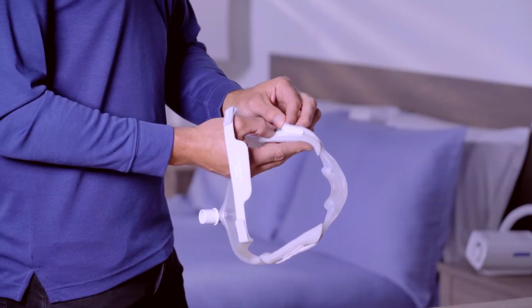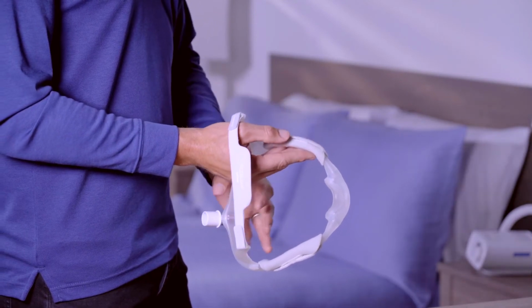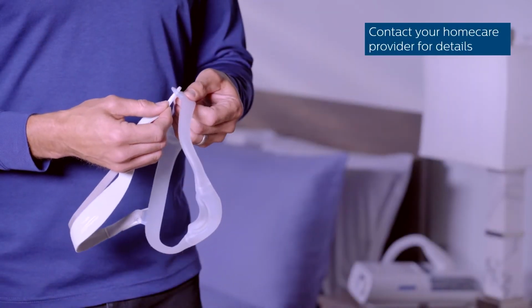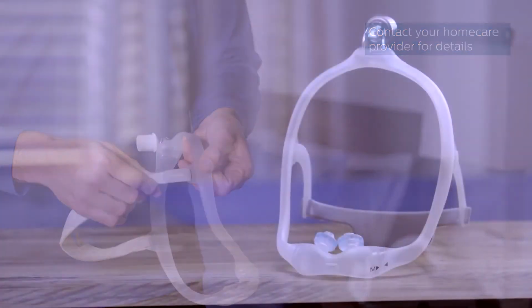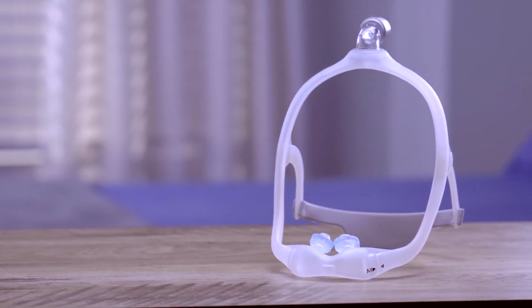As an option, you can add soft fleece wraps around the sides of the frame for added comfort. Position the seams on the outside, away from your face. There is also an optional headgear available for people who prefer one made entirely of fabric. Follow the same steps to assemble the DreamWear mask using a gel pillows cushion.